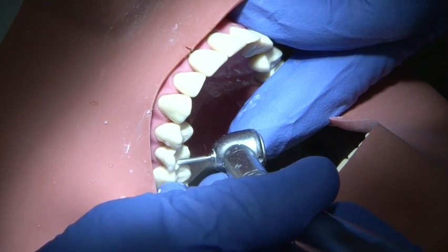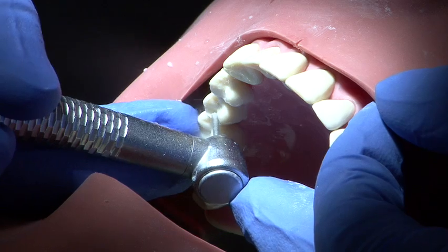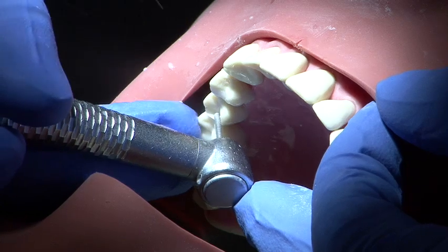The palatal surface is then reduced to a depth of 1mm to allow for metal only. Again, the outline of the natural cusp form is retained.